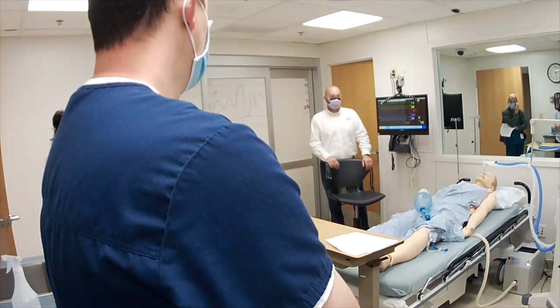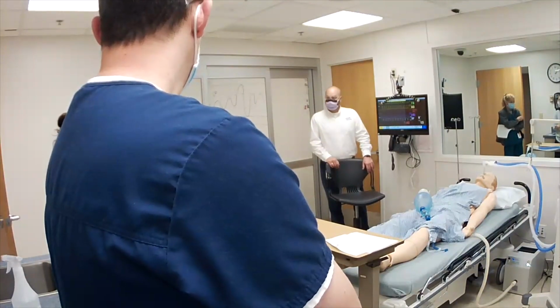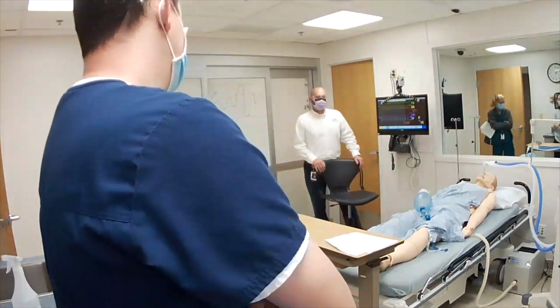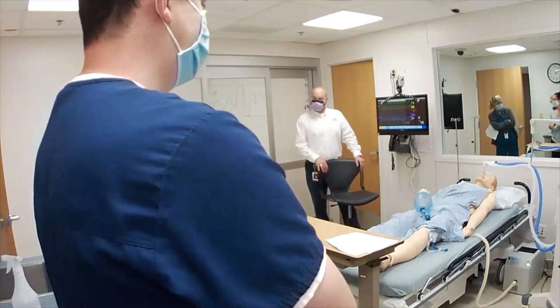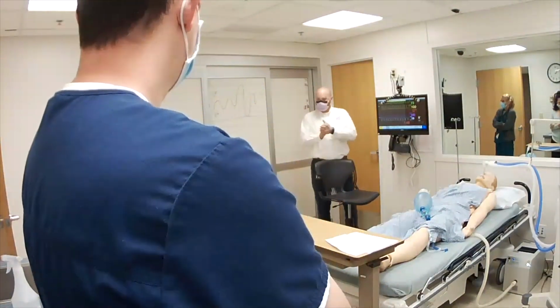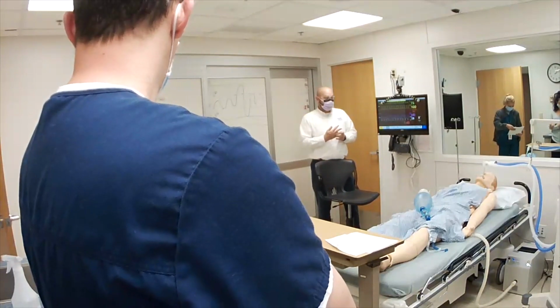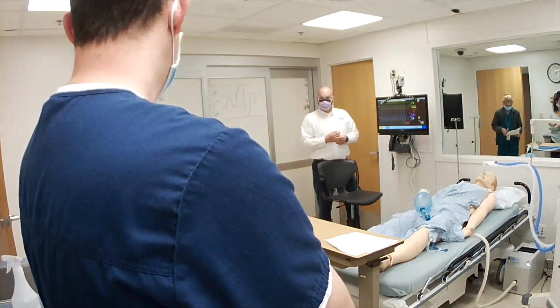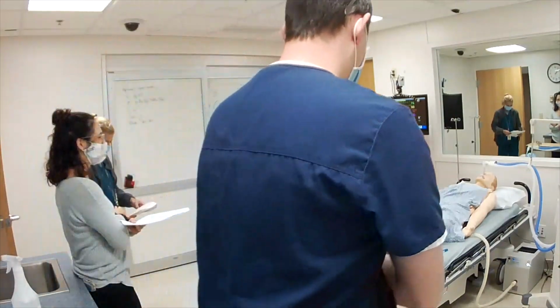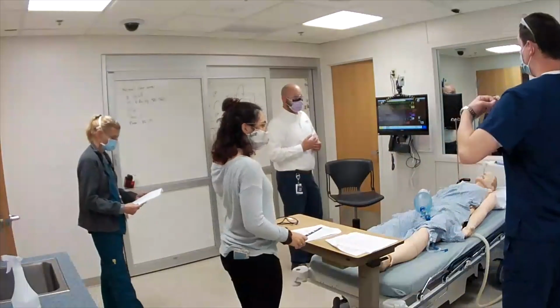The next one, where I was explaining the difference between compliance, elastance, and resistance. Next page, yes, that's where we were. Shannon, next page for us, on the vent there. Next page of values. Go ahead. Next page on the values on the vent. See the additional values there? I don't think we missed anything in this. MVI is the same as calculating basically just rate and tidal volume, right? So we know what the MVI is. We don't have to have the vent tell us that necessarily. So go to the next page.